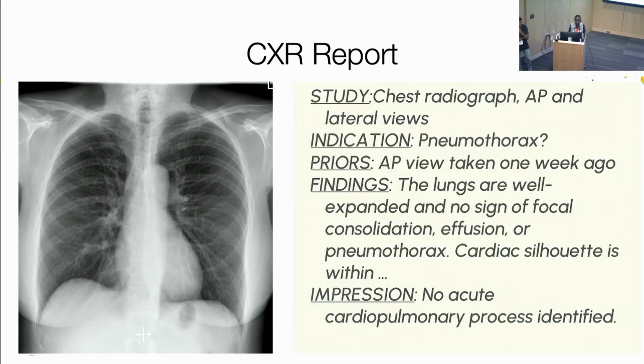So let me give you an example. If we have a CT of the abdomen and somebody's looking for appendicitis, in the findings section we'll write the appendix is dilated, inflamed, hyperemic with surrounding fat stranding. There is no free air. There is no abscess. That'll be the findings section. The impression section will say acute uncomplicated appendicitis. So aside from the word appendix, we didn't re-mention any of those sentences or phrases.